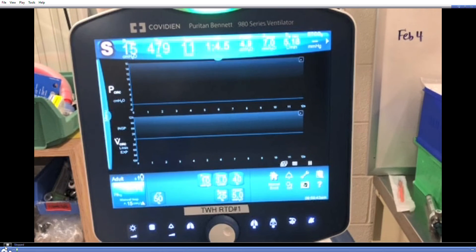The PB980 also does not permit inspiratory pauses during respiratory efforts. Therefore, we cannot obtain plateau pressure in this condition.